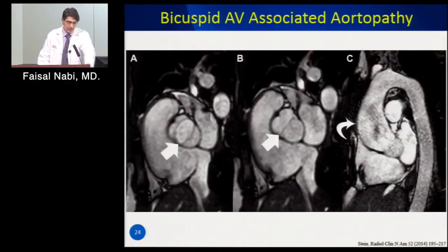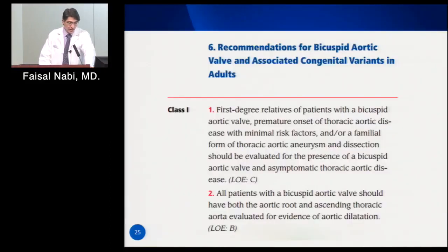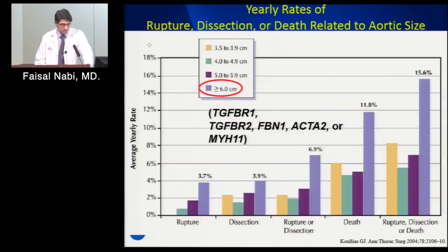junction as well. And if you look closer, it's so important in these studies that we do that when you do have enlargements of the ascending aorta, a very simple cause for it can be a bicuspid aortic valve. And this is just a reminder that if you look just a little bit low at the valve, you may very well make the diagnosis of what is wrong with this patient. And these are just screening recommendations. As you know, with patients who have bicuspid valves, it's very important to screen first-degree relatives.